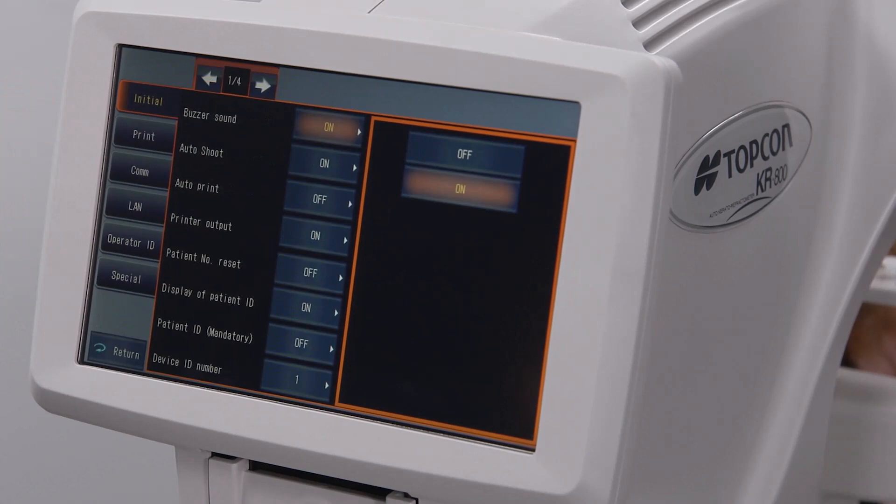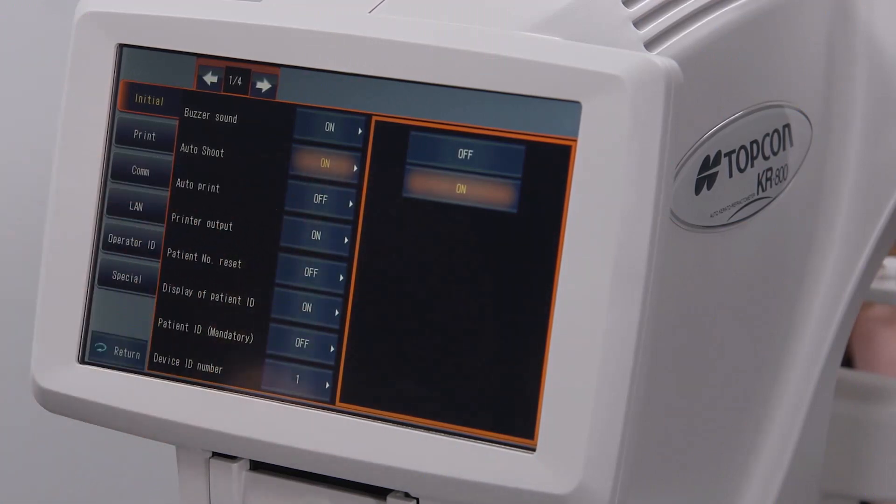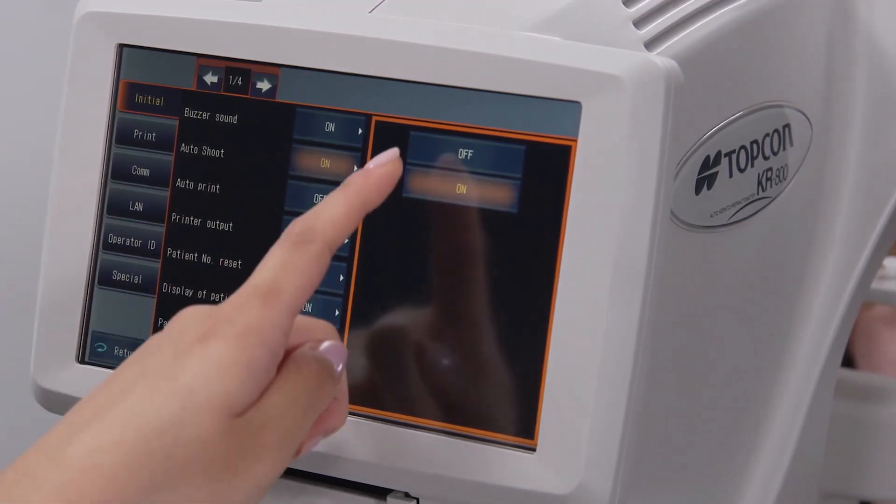Of these settings on page 1, these will likely be of most interest. If you'd like to start the tests automatically, make sure that Autoshoot is on. If you want to start the tests manually, make sure that it's set to off.